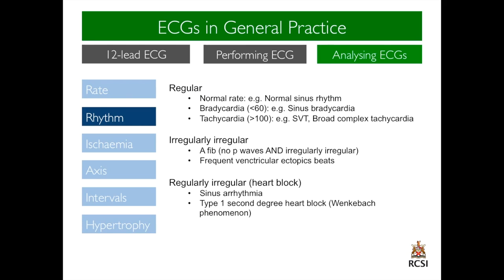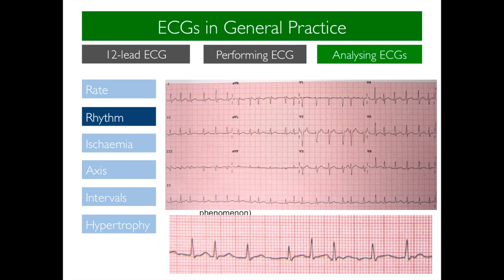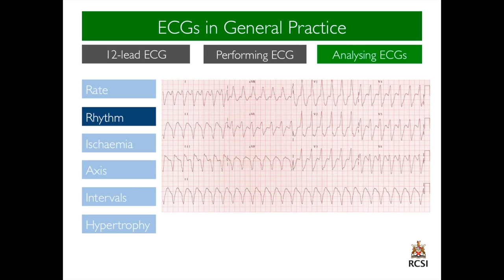Moving on to rhythm. The rhythm can either be regular, irregularly irregular, or regularly irregular. As an example, this 12-lead ECG and its rhythm strip below show an irregularly irregular rhythm and no P waves — this is atrial fibrillation. This next 12-lead ECG shows a broad complex tachycardia; in this case, ventricular tachycardia.